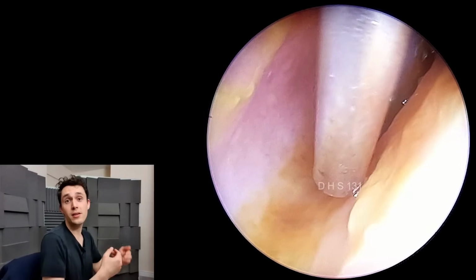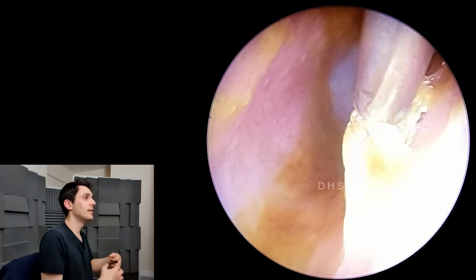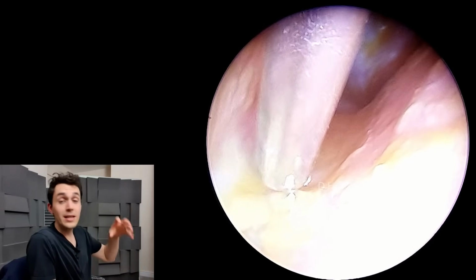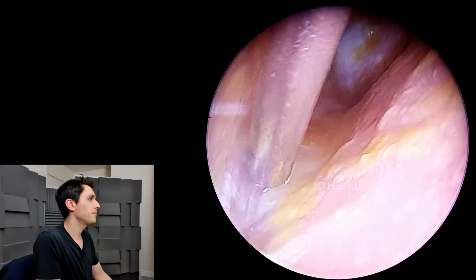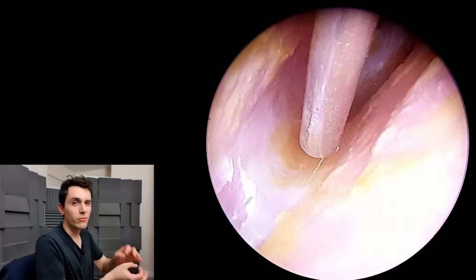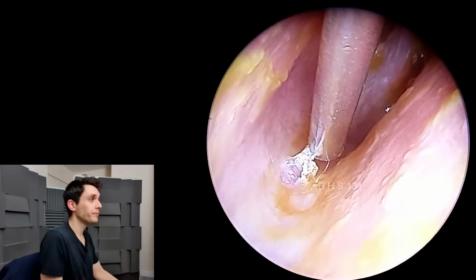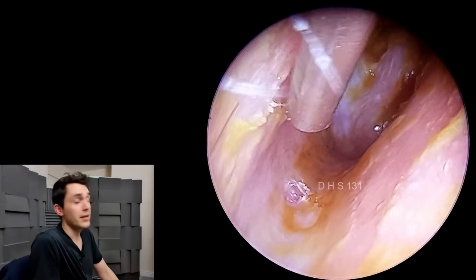The outer third of your ear canal is nice and squishy and cushiony, there's cartilage, fat, and so on. It doesn't really matter if you scrape around with the suction probe. It's not going to do that much damage. But in the inner two thirds of the ear, it's very thin skin on bone. We're talking a 1/10 of a millimeter layer of skin on bone, which is really, really sensitive. It is very uncomfortable, very painful, in fact, if you knock against it or put too much pressure on it. And it's not too difficult to lacerate the skin, because, again, it's just skin on bone.